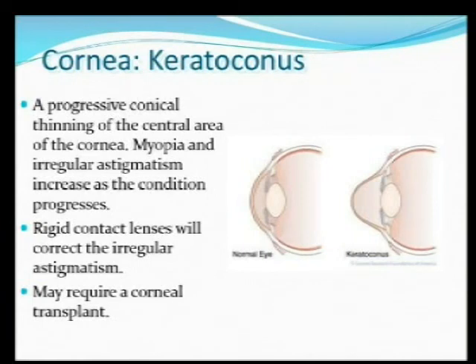About the only way to properly maintain or preserve their vision is to use a rigid contact lens to fill in those irregularities. For many years, that's been a specially designed corneal contact lens for keratoconus, and we'll talk a little bit about that on Sunday. Today, though, there's starting to be more of a shift to utilizing scleral lenses to manage advanced keratoconus, and we'll talk about those as well.